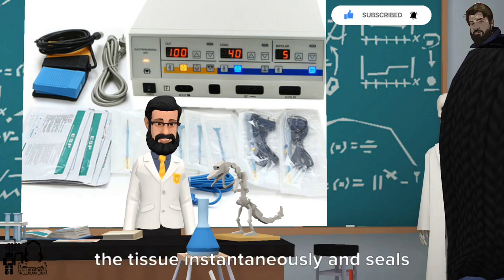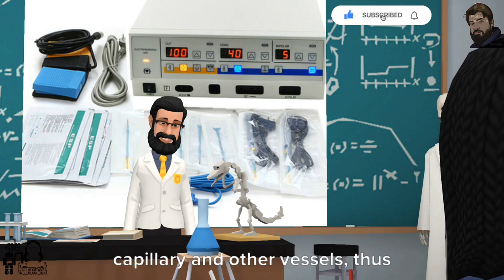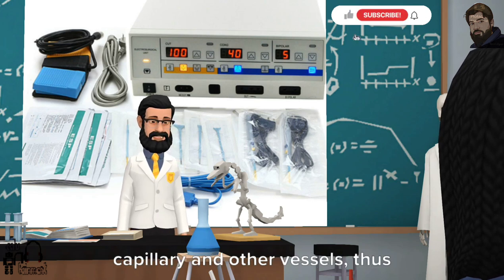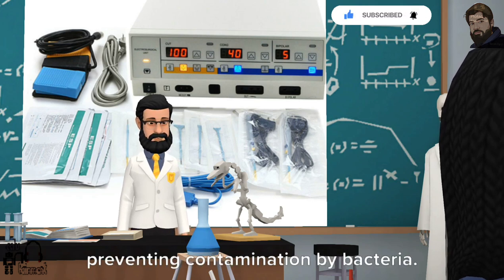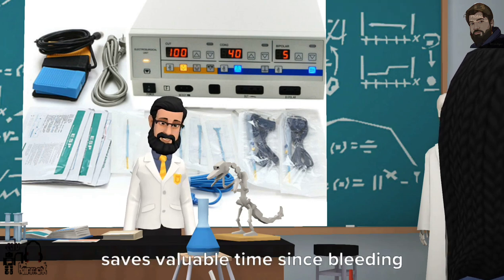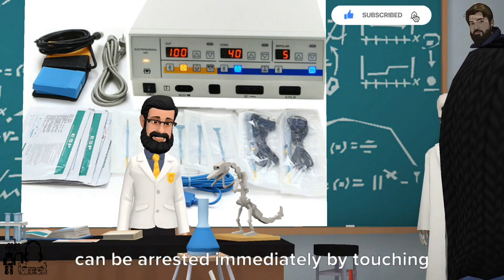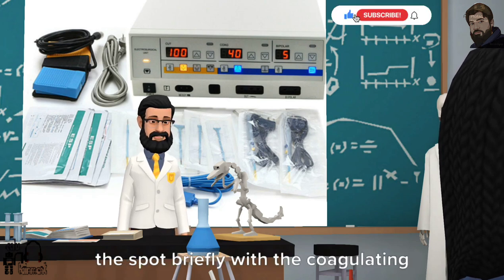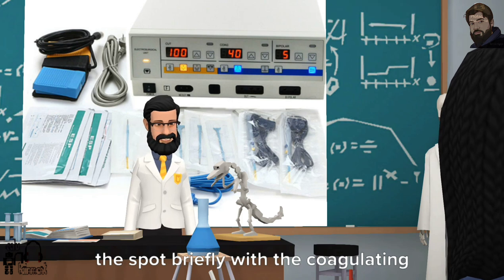The electrode virtually melts through the tissue instantaneously and seals capillary and other vessels, thus preventing contamination by bacteria. A simplified method of coagulation saves valuable time since bleeding can be arrested immediately by touching the spot briefly with the coagulating electrode.